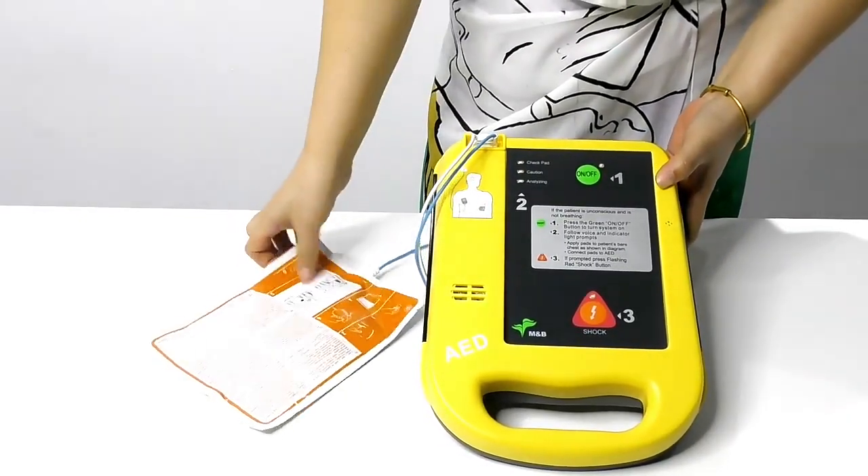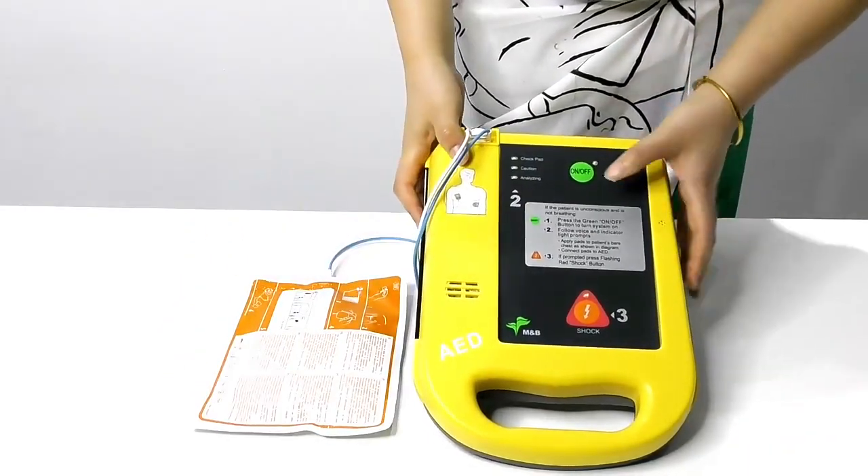First, we connect the pad to the device. Then we turn it on.